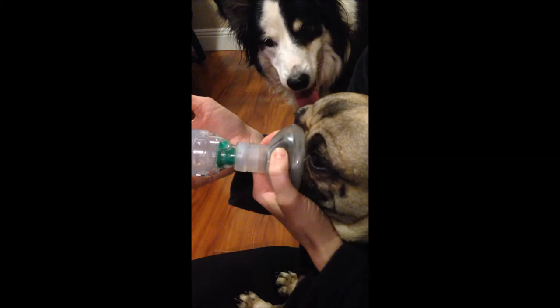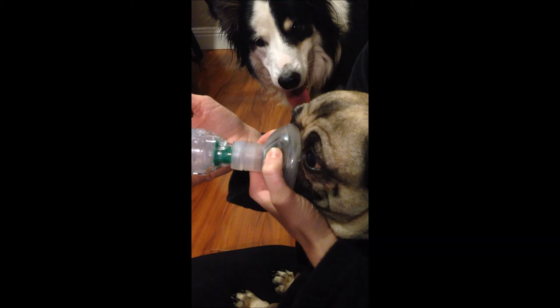If he squirms, it's not ideal, but if he squirms away during the first initial breaths, you can redo it.